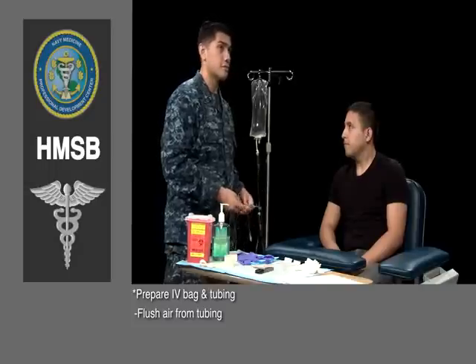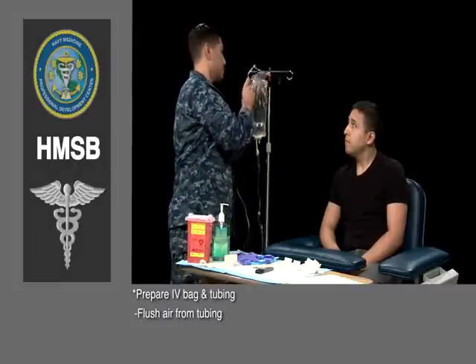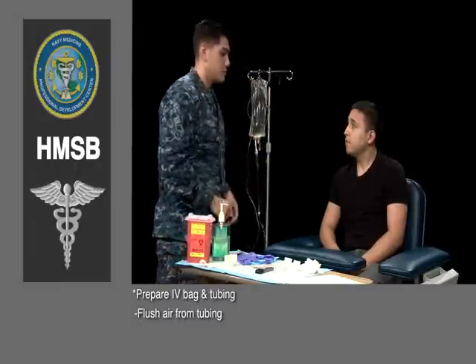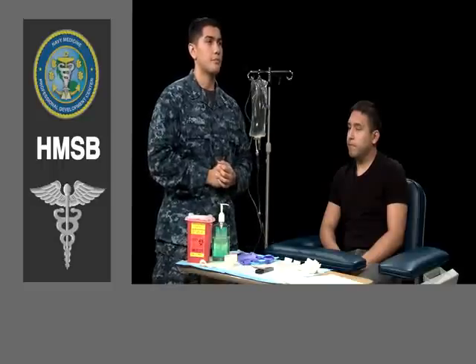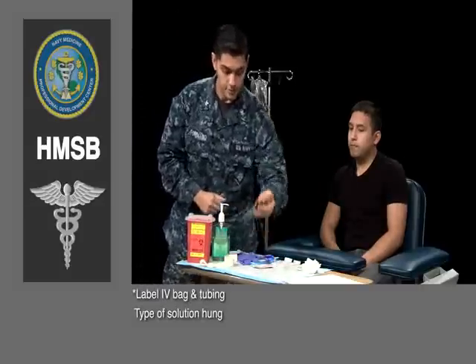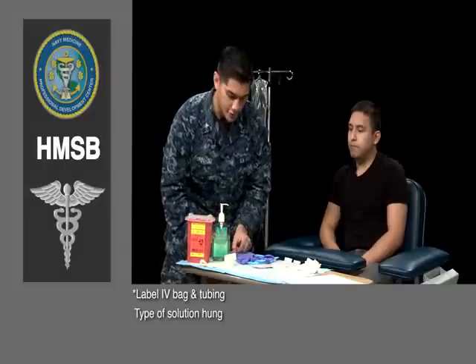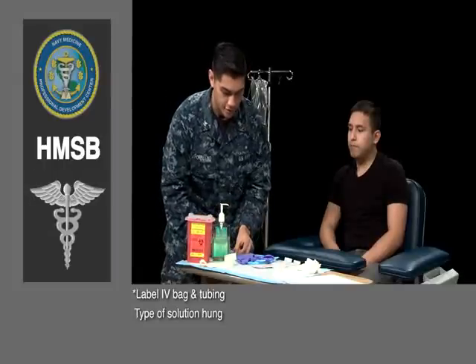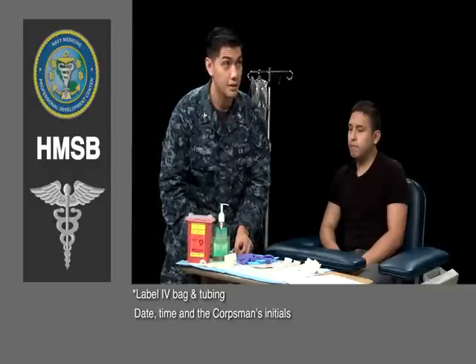Once the air is flushed, I'm then going to clamp the line again. Next, I need to label my bag. I'm going to label the solution, the date, the time, and my initials.